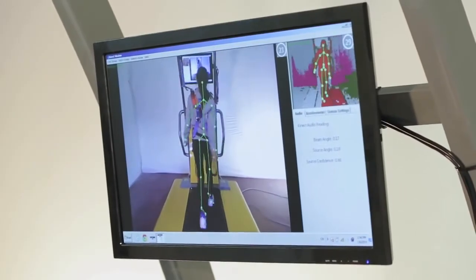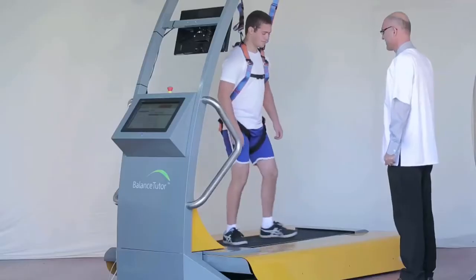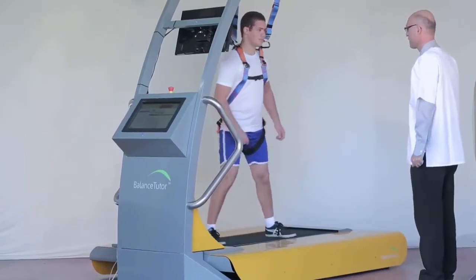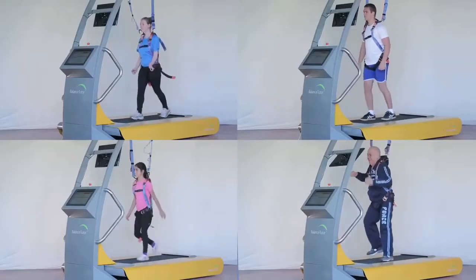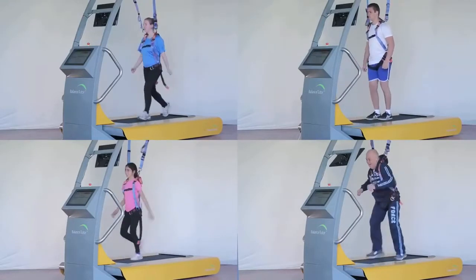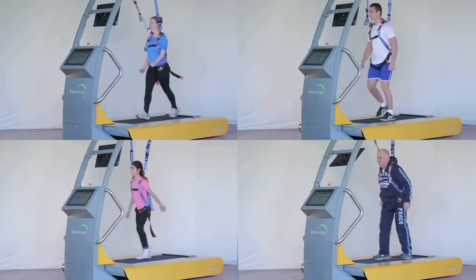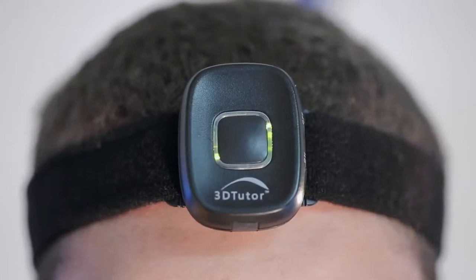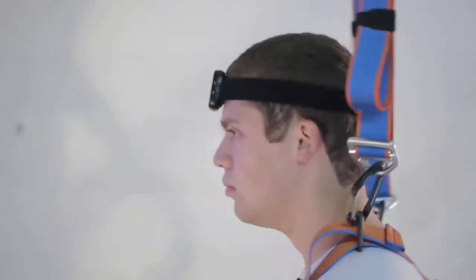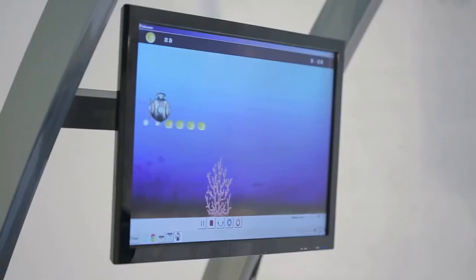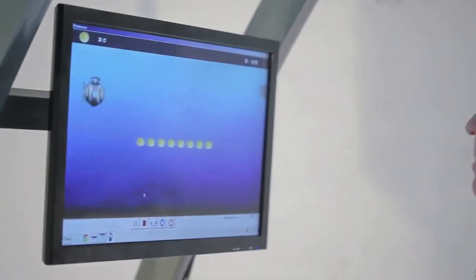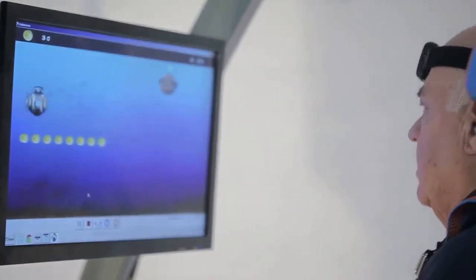In addition to the direction of displacement, the speed and dosage of perturbation can be customized to the patient's ability and rehabilitation needs. Movement biofeedback and instructions on functional body position can also be provided during training. The patient is therefore challenged during training while standing, walking, and even running.